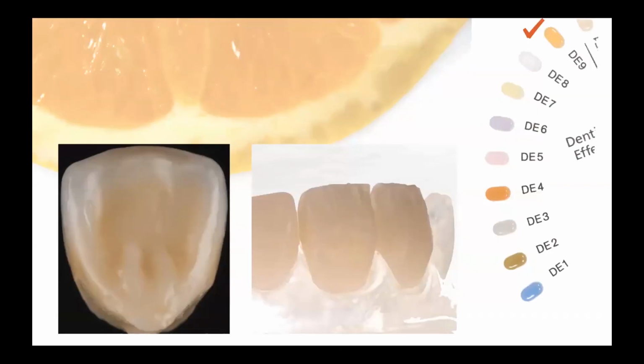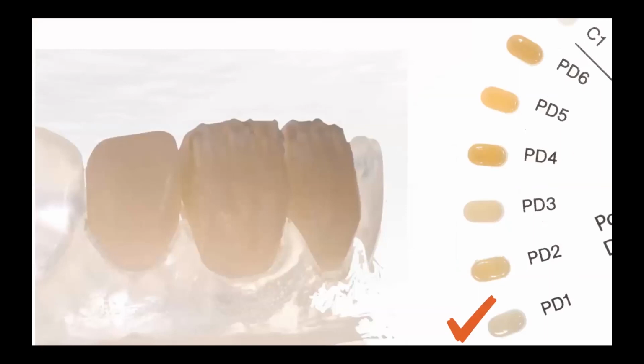I'm about to finish my lecture, and I would like to say a couple of words about using effect masses. Remember to use orange dentin effect. We can emphasize the area under the mamelons, or emphasize the lingual or palatal aspect of the front crowns. We can emphasize our mamelons with the help of a bright powder that has increased chromaticity, and that effect will be very smooth.